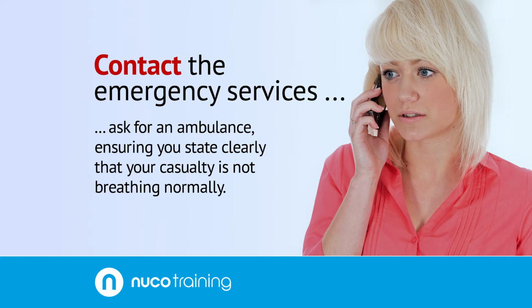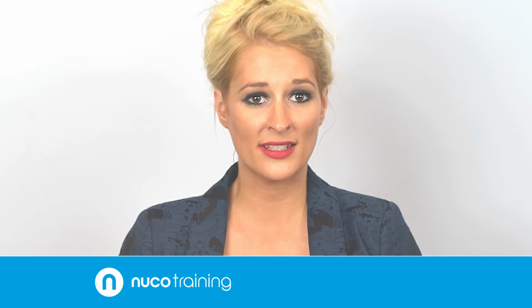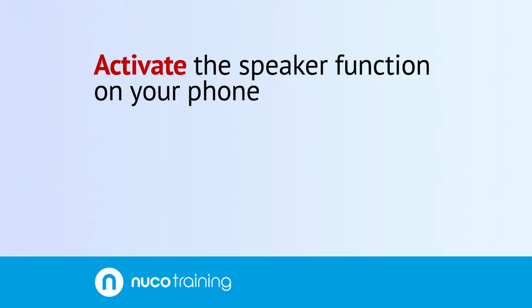Your immediate action now is to contact the emergency services and to ask for an ambulance, ensuring you state clearly that your casualty is not breathing normally. If you have a bystander, then ask them to make this call. If not, you must make this call yourself. If you are able to, activate the speaker function on your phone to aid communication between you and the emergency services. Commence CPR without delay.